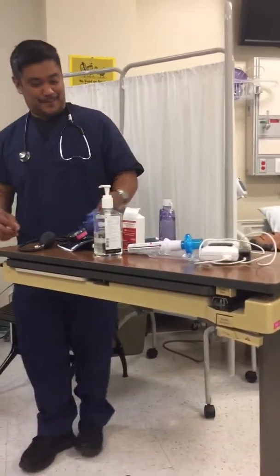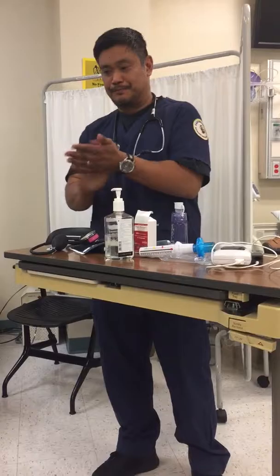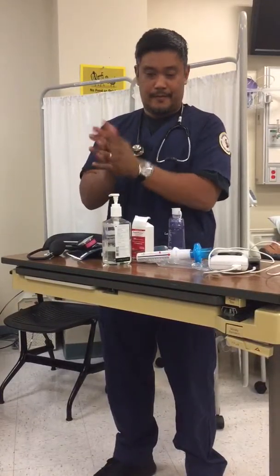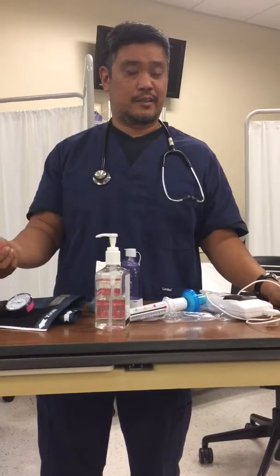I appreciate it. So we dispose of the gloves and go ahead and sanitize the hands once again. And when we exit the room, we go ahead and do our charting, take note of the patient's vitals pre and post, and take note of how they look, cyanotic or working to breathe, so the patient sounds okay. The breath sounds did have a little bit of crackle in the lower lobar area on the left. That cleared up a little bit after the treatment.